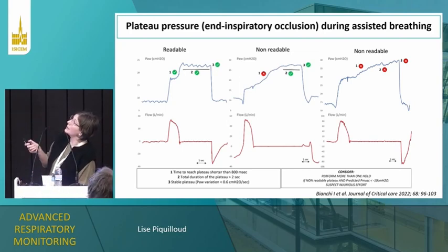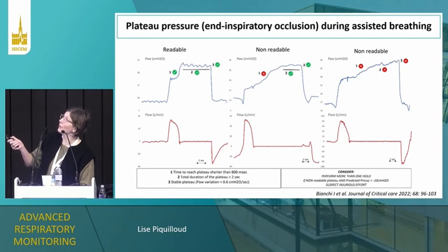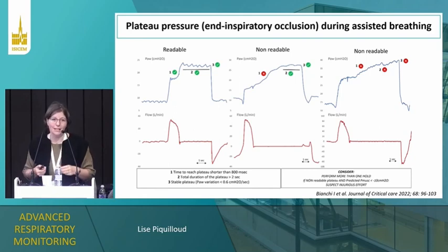If you prolong it, the problem is that then you are going to have a new inspiratory effort. And then you are going to have a decrease here. It's going to give a plateau, and then a decrease, and then again the plateau, but it's difficult. And the patient feels this maneuver. On PO1, no, because it's too short, but here it's during all inspiration, then it's sometimes easier to tell the patient, I'm going to stop the machine. It's going to be a bit strange, but it's not dangerous, because they really feel it when they are awake.